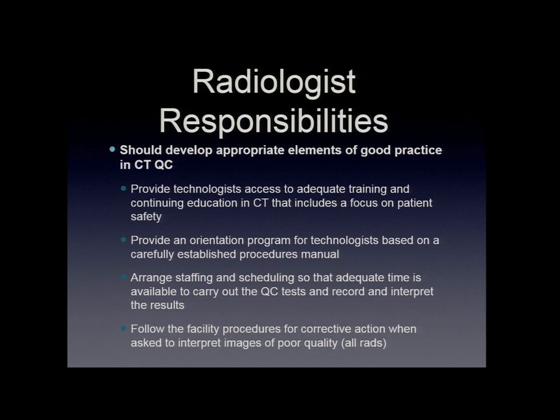Now, part of this, in order to be effective, you have to have a participating team that's going in there that's well trained and has the time to conduct an effective QC program. So they need to provide the technologists with adequate training.